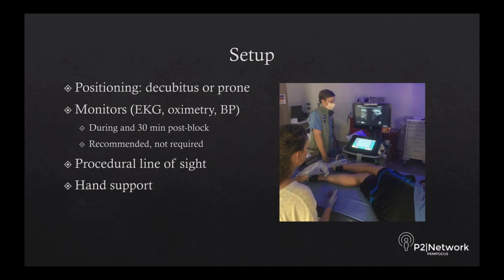Setup for the block is shown here in the image on the right. You typically want to have your patient either decubitus or prone positioning. My personal preference is decubitus positioning. That provides a nice access to the medial lower leg as shown here.